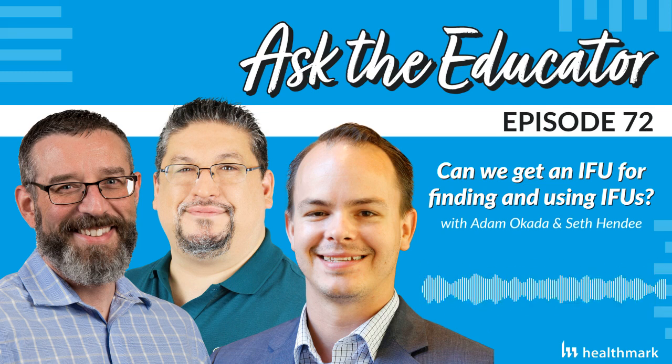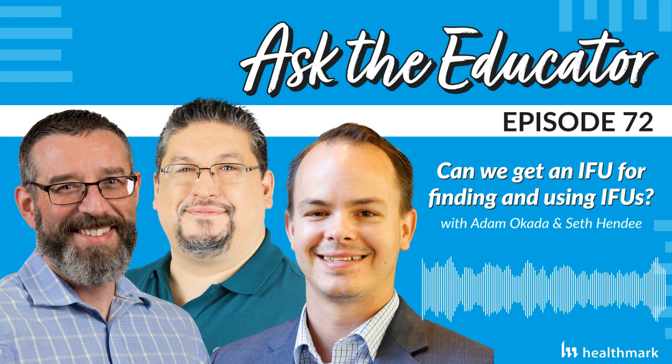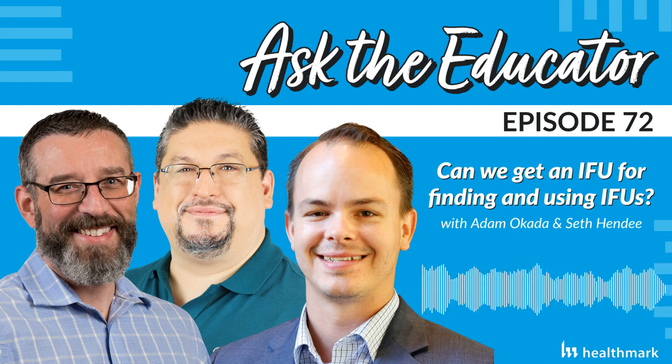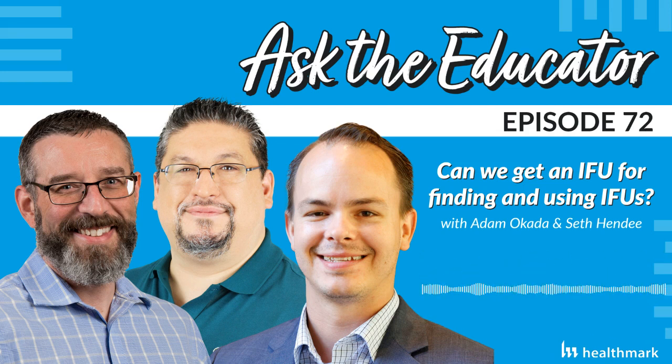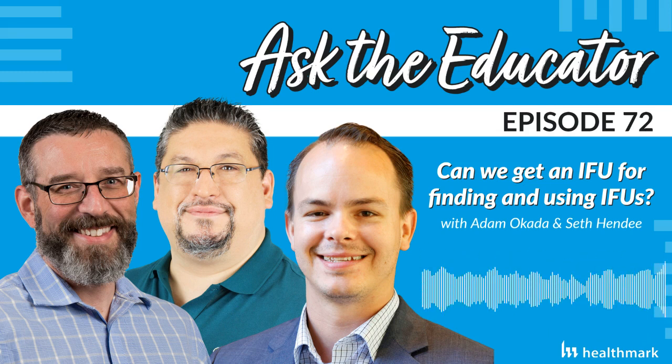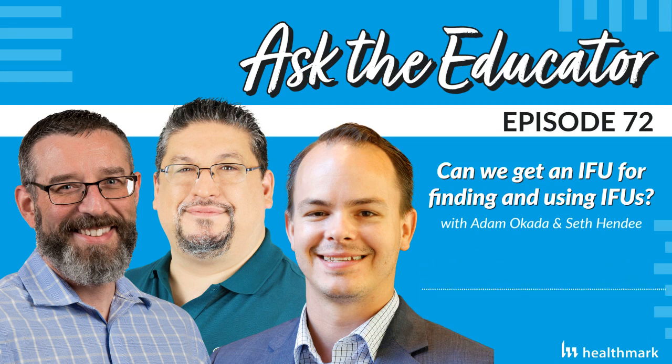One of the things that came to my mind about this is historically, when we thought of IFUs, and I'm guilty of this as well, when I asked my staff back in the day, did you look at the IFU? Did you get the IFU from the rep for the loaner tray or what have you? And they're like, "Oh yeah." And I'm like, "Well, what's required? Do we need to do anything?" And they'd rattle off the sterilization parameters like 270 at 4 minutes and 30. So we're good. And I'm like, "Well, what about all the other stuff? Like manual cleaning? What about automated cleaning? What about inspection? What about all of that stuff?"